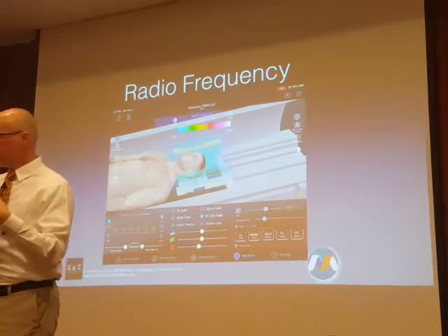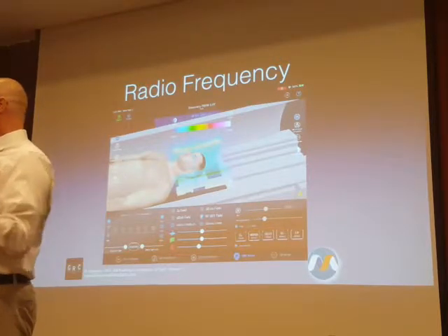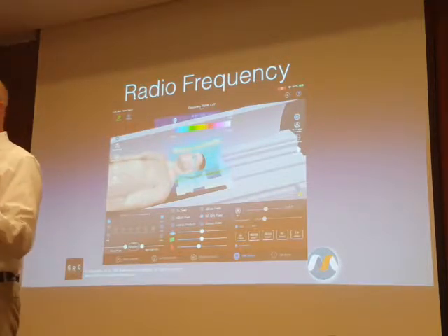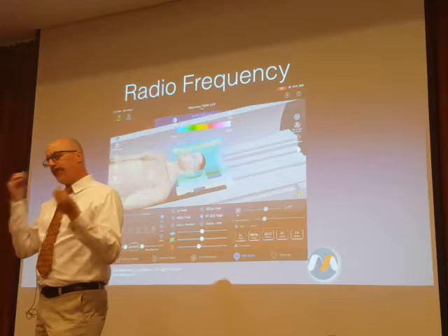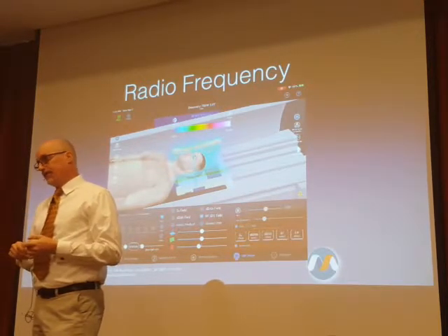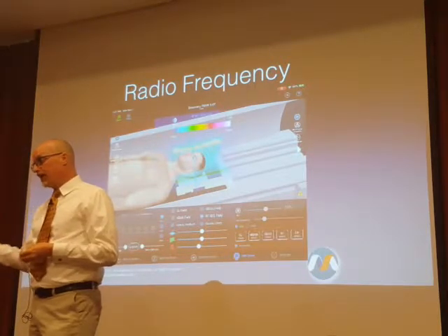What that also means is when you have a large patient, an obese patient, and you see 2 watts per kilogram and think, oh, that's normal mode, that's a modest amount of radiofrequency energy, you have to think in your mind, oh, it's 2 times the 160 kilograms this patient weighs, and that's a lot of power.